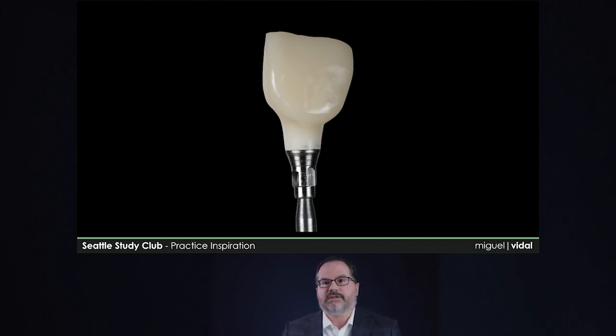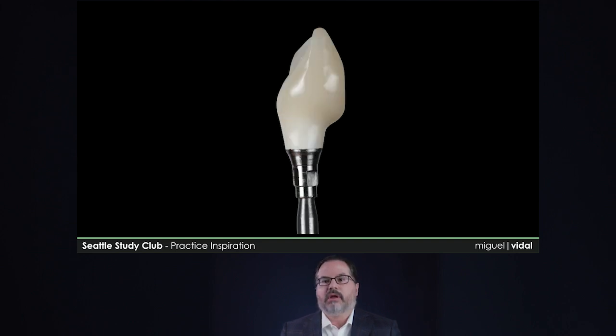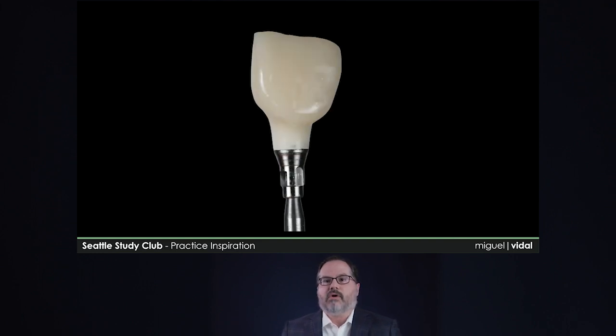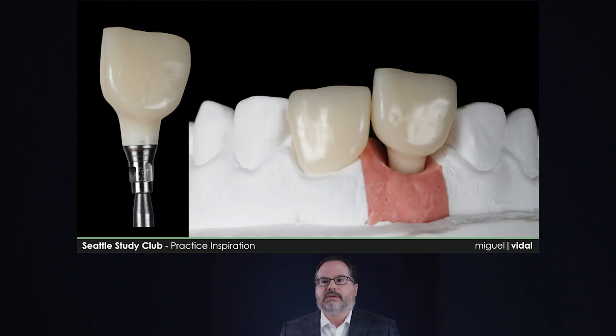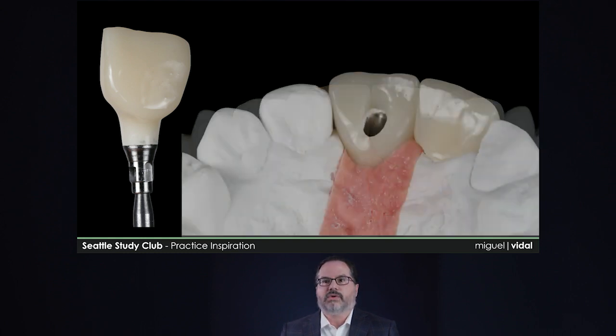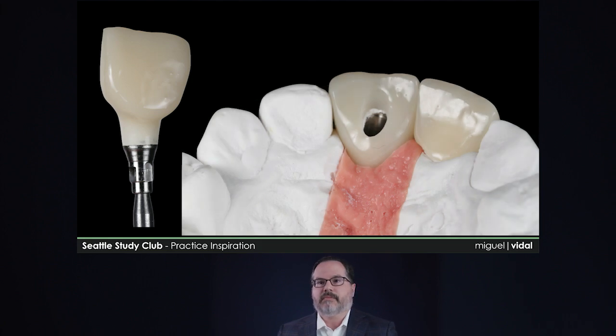You can see how thin it is until it becomes right about 1 millimeter to 1.5 millimeters at the gingival aspect, and that's where we start contouring and creating the bulk in the critical aspect to drive up that tissue. And from different views, you can see how a nicely contoured provisional needs to be done. Then we're going to go from our working cast to seated, so you can see how the tissue will be supported in this area, and a screw-retained aspect on the lingual.